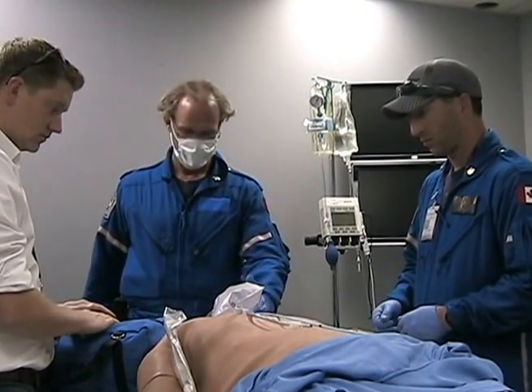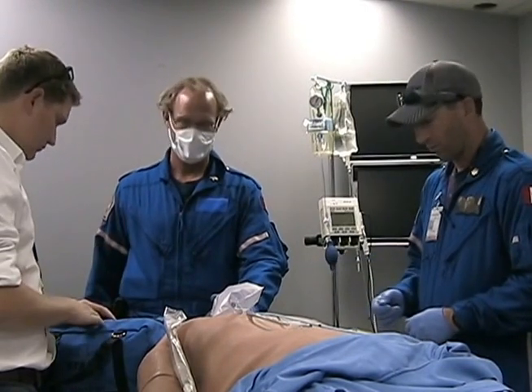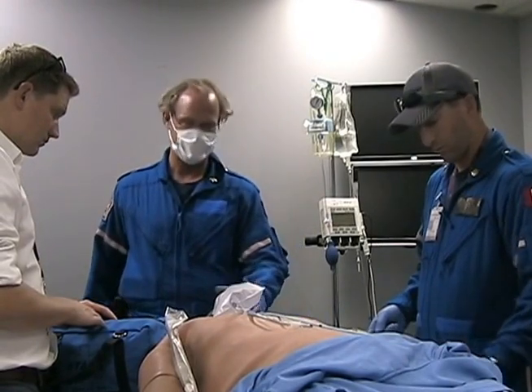OPA plus minus NPA. Yep, both are in. Suction tested. Suction has been tested. Laryngoscope tested plus minus CMAC on. Yeah, so they've both been tested, both blades, and if we had the CMAC, it would be on as well.